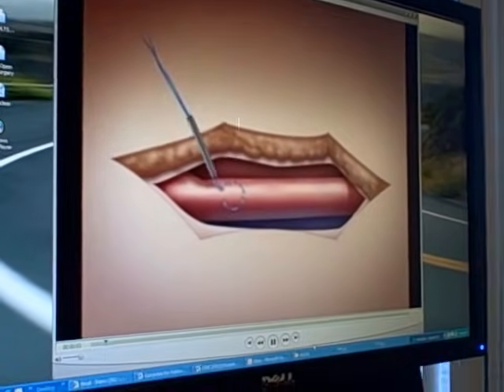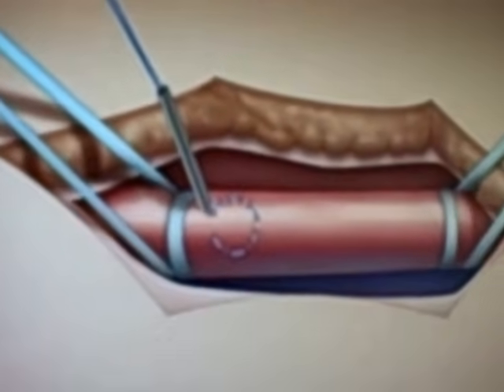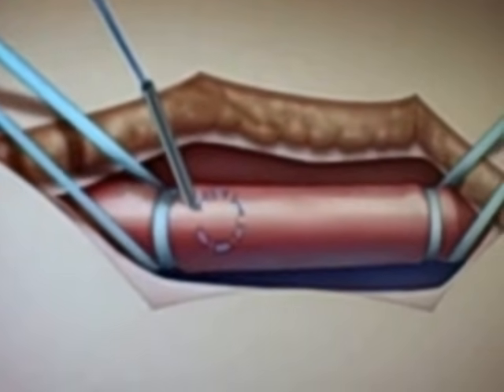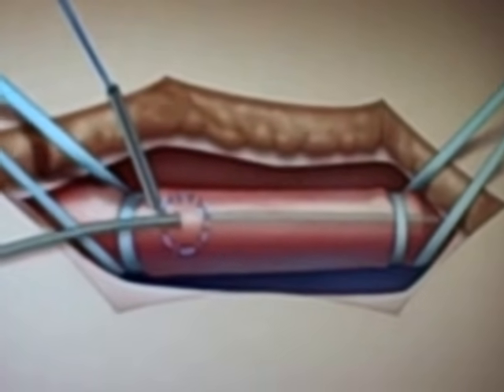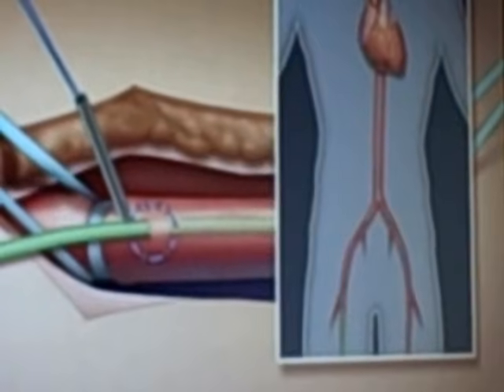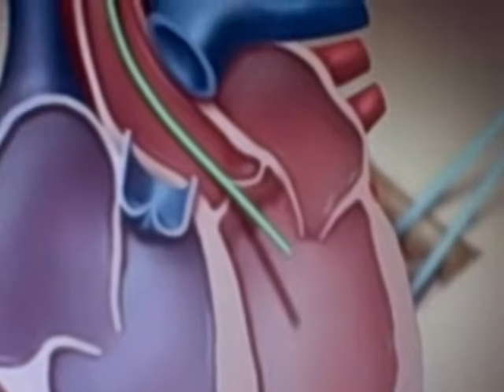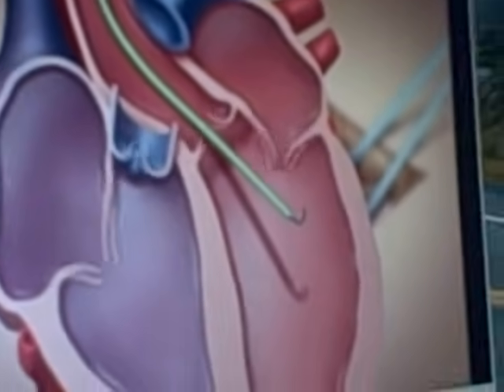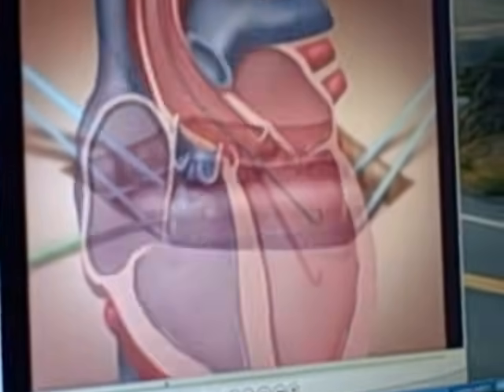First, a small incision is made over the femoral artery, and a purse-string suture is placed around where the insertion into the artery will be made. A small catheter is placed through that purse-string, followed by a larger catheter. That catheter is then advanced into the heart, and once the position in the heart is confirmed, a wire is placed through and the catheter is withdrawn back.